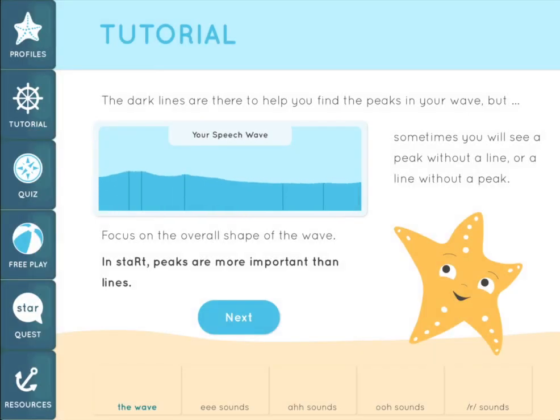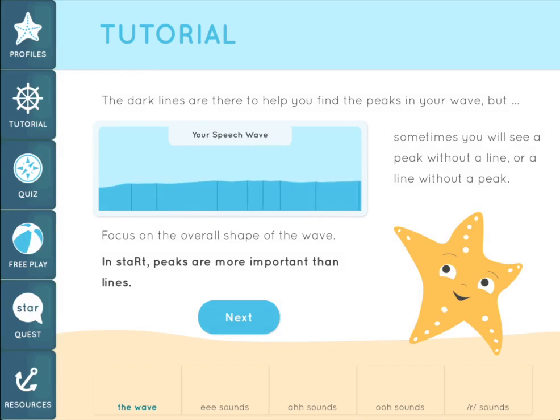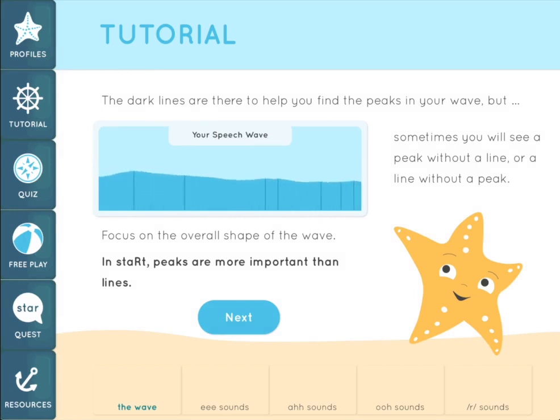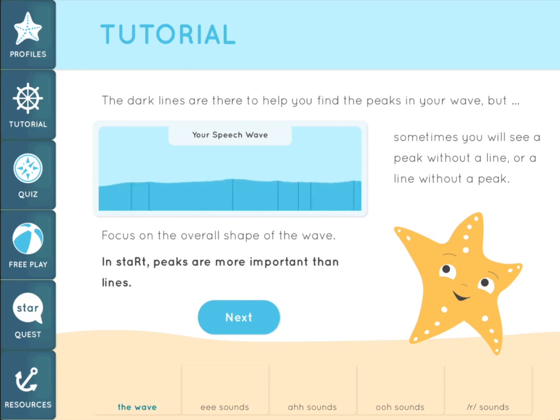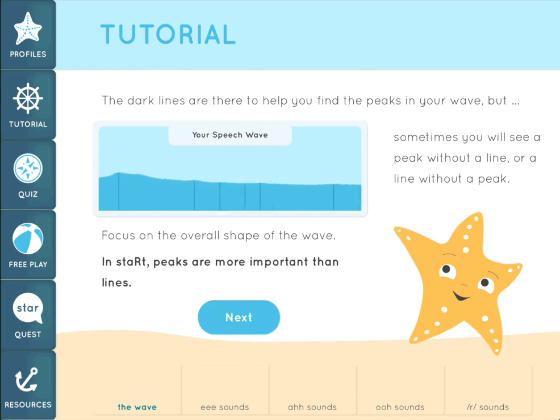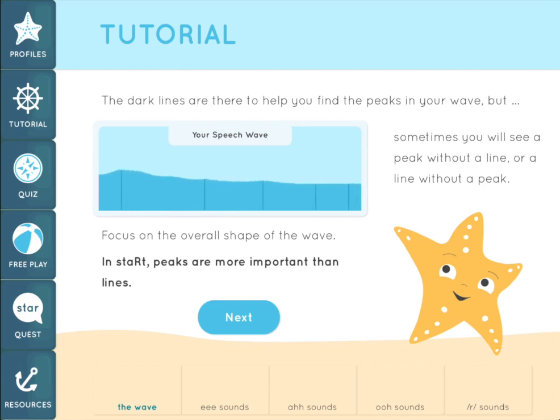The vertical lines under the peaks are there to help you find the peaks in the wave. Sometimes a peak may appear without a line, or a line may be visible when there is no peak. The focus when using START will be on the location of the peaks along the wave, not necessarily the location of the lines.